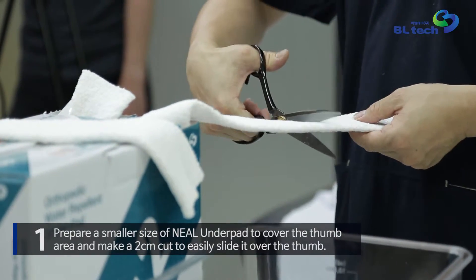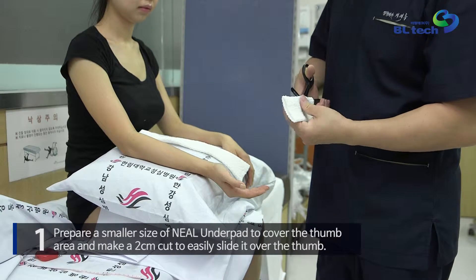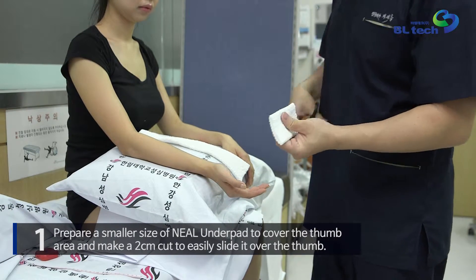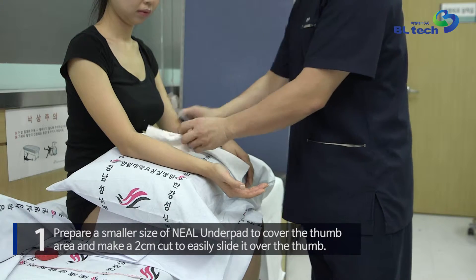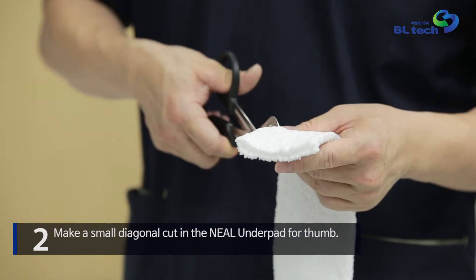Prepare a smaller size of Neal Underpad to protect the thumb area and make a two centimeter cut to easily slide it over the thumb. Then make a small diagonal cut in the Neal Underpad for the thumb.